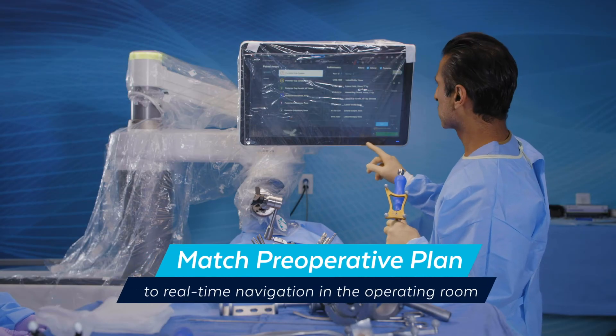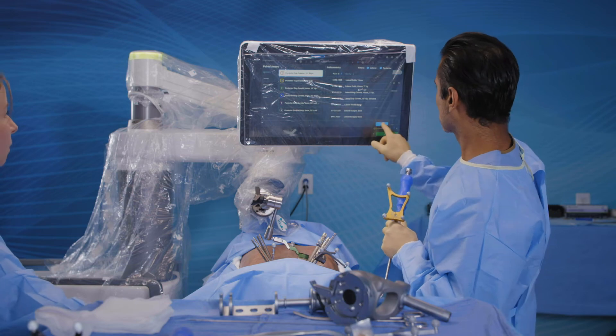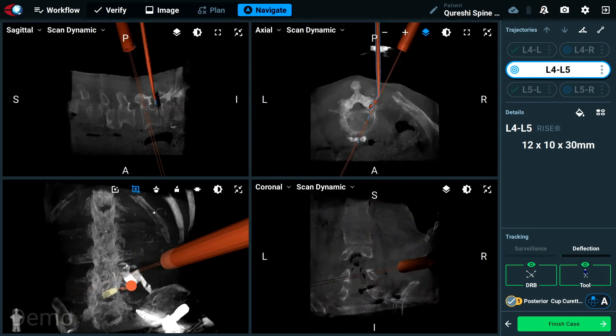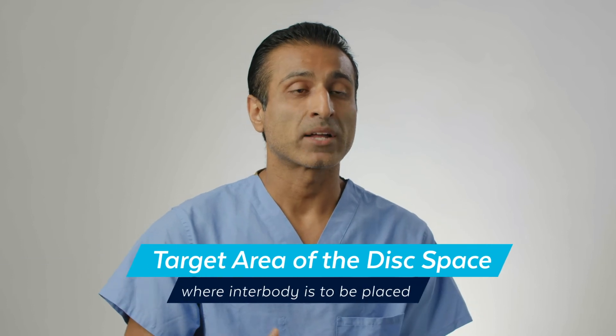At the same time that I'm preparing my disc space, I can actually see the instruments that I'm using to prepare the disc space overlaid on top of where that interbody implant is sitting. The big advantage here is that I can now make sure that I am actually preparing the area of the disc space where my interbody implant is ultimately going to sit. And I can only imagine how helpful that's going to be to the fusion rates in our patients.